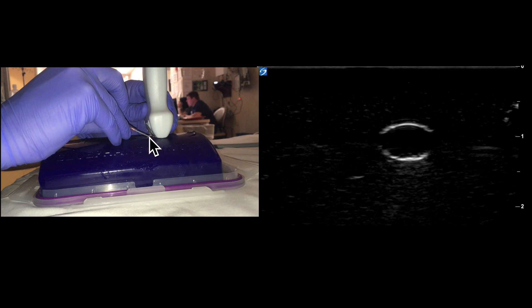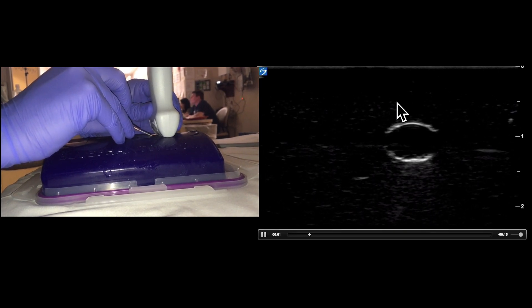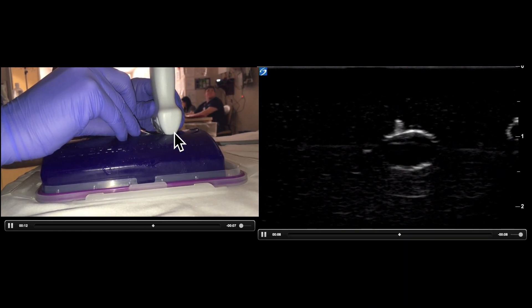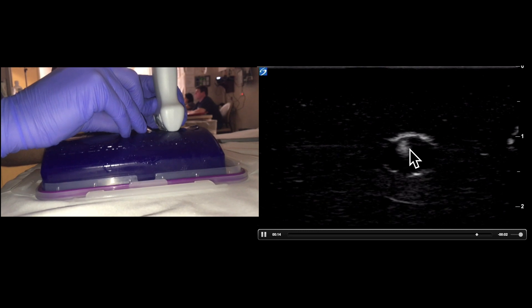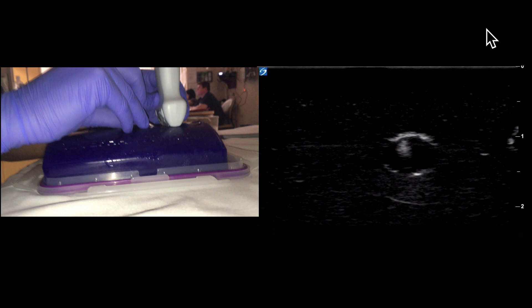Now we're going to see this on a blue phantom. I first insert the needle, then bring the probe back to find the needle tip, which will show up as a hyperechoic lesion. Then the probe advances, and the needle comes into view as the needle tip is moved. The needle goes under, we come back and find it, move the probe forward, and the needle follows. We get right on top of the vessel, tent it, advance just a little more, and we can see the needle tip right in it — we've never lost visualization of the needle tip and know we're right into the vessel without going past it.